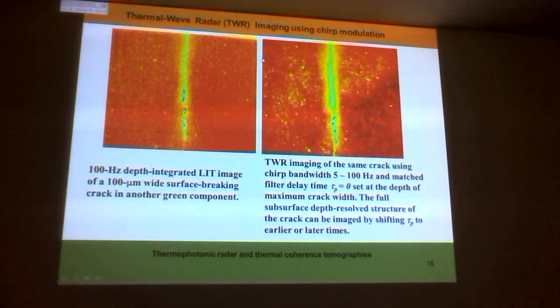So for the camera itself, the problem with the signals is that they come in at low frequencies. You end up having 1/f noise. Because you work in low frequencies, you want to go in depth, and 1/f is the one that is giving you the majority of the noise.